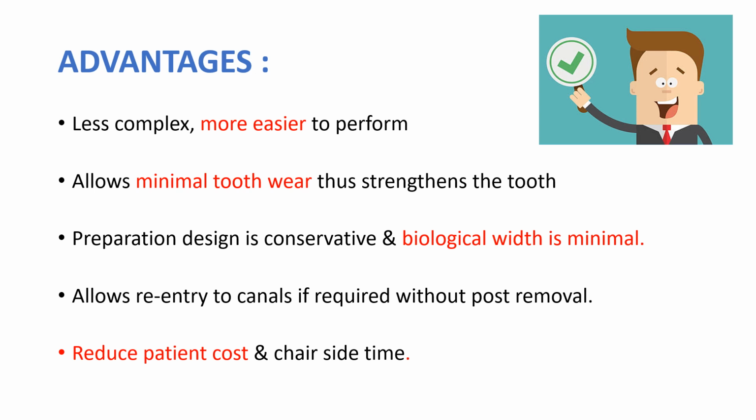Allows minimal tooth wear, thus strengthens the tooth. Preparation design is conservative and biological width is minimal. Allows re-entry to canals if required without post-removal. Reduced patient cost and chair side time.